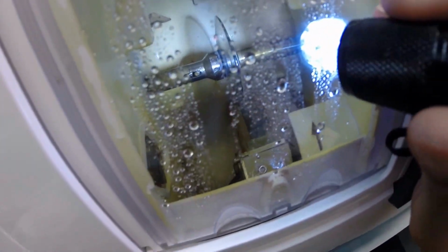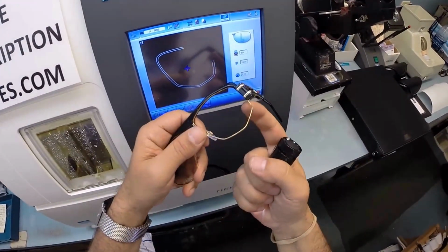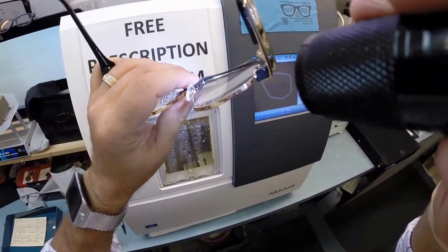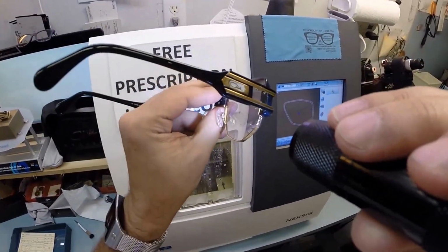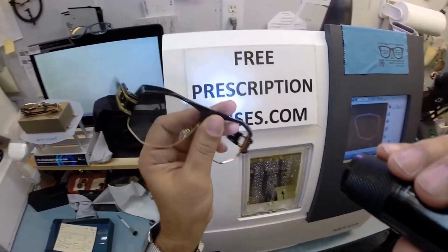The clamps shut and the lens is going to be traced by the two white styluses, again making sure that it's large enough to fit into the frame. And you can see as it's going around tracing the shape of the lens. And again, the old carpenter saying, measure twice, cut once, measuring the thickness of the lens at every point to know exactly and precisely where to place the bevel so you have the least amount of edge thickness showing. And of course, you've got no edge thickness whatsoever, even in a large oversized frame, which is always a concern because your lenses are thin at the center and thicker at the edges, but again, no edge thickness whatsoever.